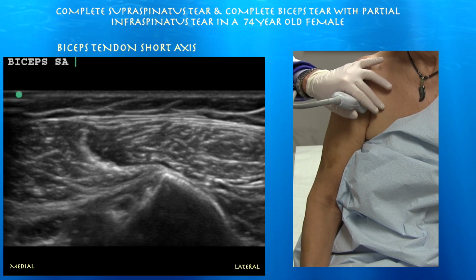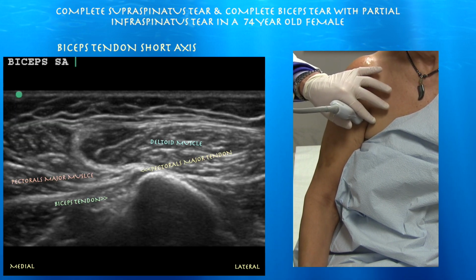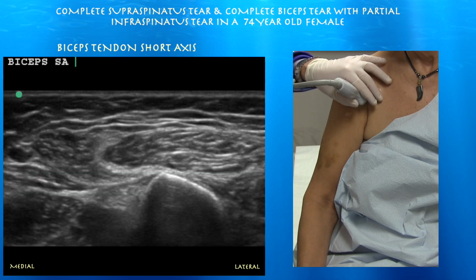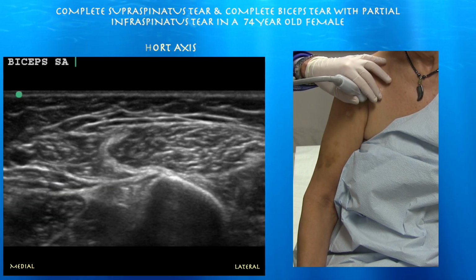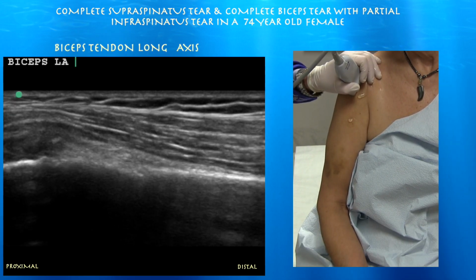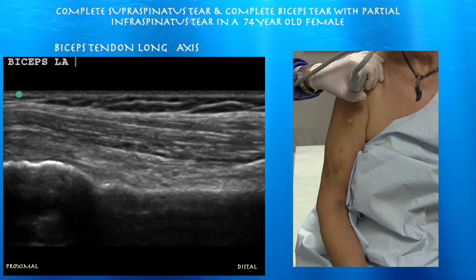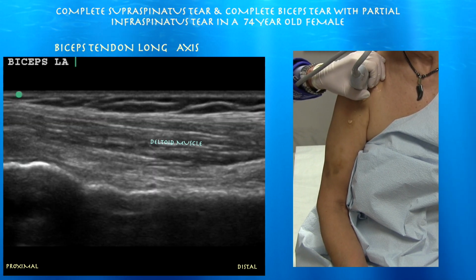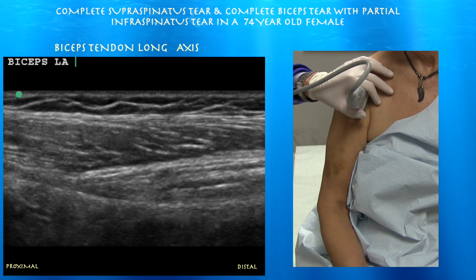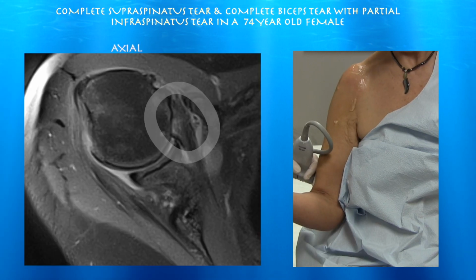As we go distally, you can see the pec major tendon. And then you can see the biceps tendon here distally just before the pec major tendon. Right side of the screen is distal. You see the nice humeral surface there, and you just don't see a biceps tendon. Let's see if we can try to find it. Here we are distally. I couldn't make out a biceps tendon. So distally there is somewhat of a biceps tendon, so probably had some retraction.